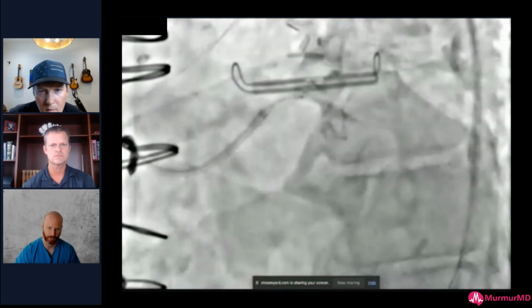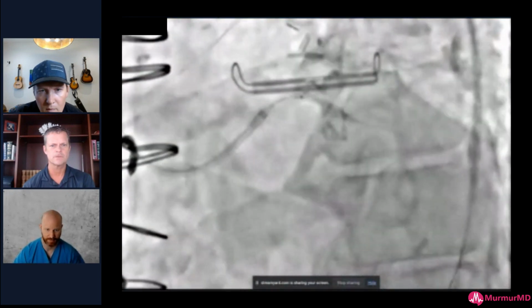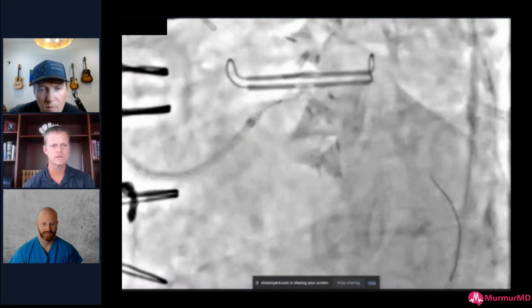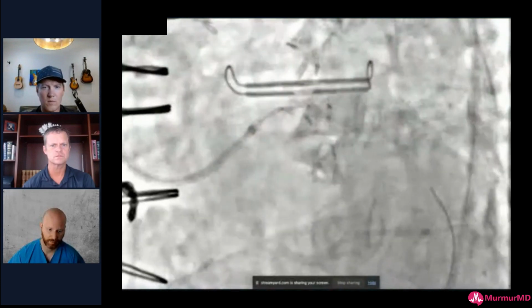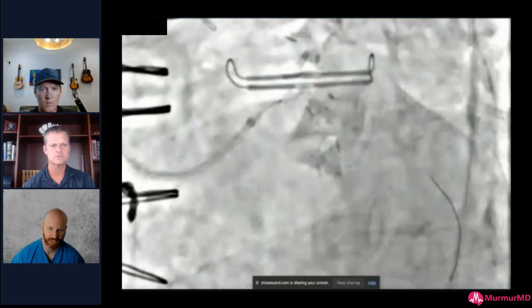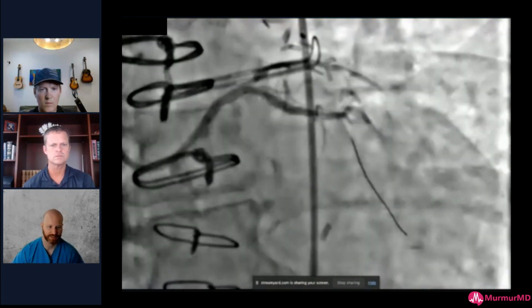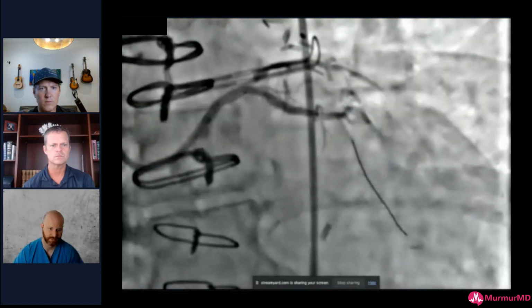And this is just me working through shocks here. Unlike some of the other cases we talk about, where I get 10 pulses in because I have concentric calcium and we modify it, these nodules take a lot of your pulses. And I think that's going to be a big thing as C2 plus comes out, because you're going to get double the pulses. And so you're going to have more of an ability to really modify eccentric plaque, because it can be really hard with eccentric calcium to get any modification of any kind with any tool.